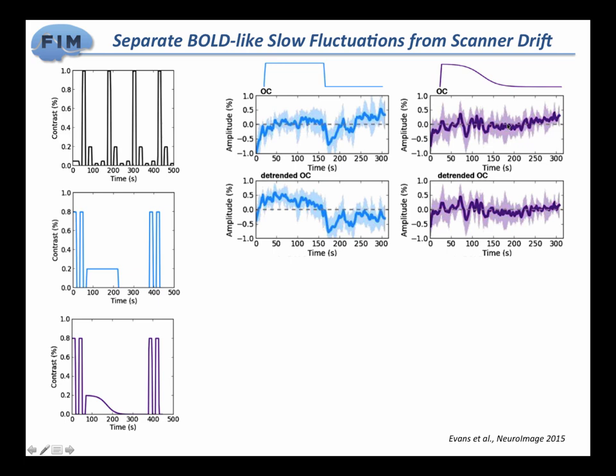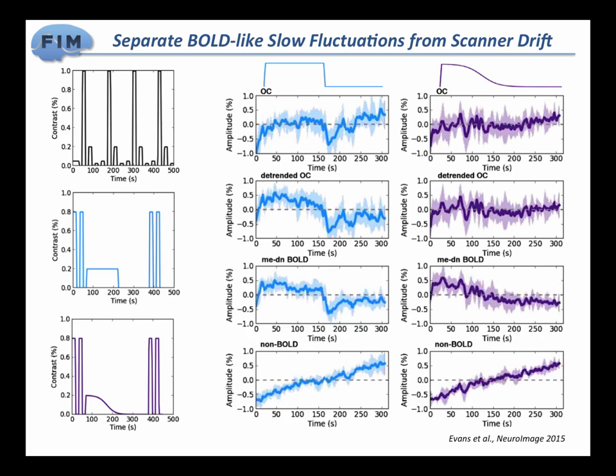So they acquire data for paradigms like this, and here what you have is the time series when you just have your normal regular data. This is after doing your detrending, in which, as I said, you just try to fit a series of polynomials, and then, well, it seems that this one you can still maybe capture it, but here you have killed all your information. So, it's really hard to do these things.